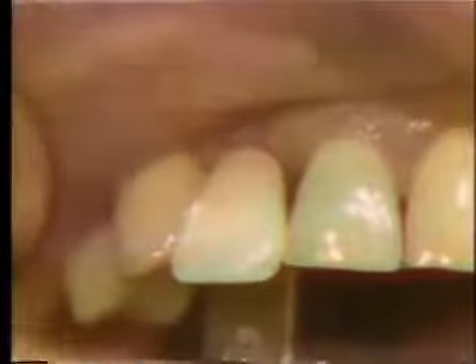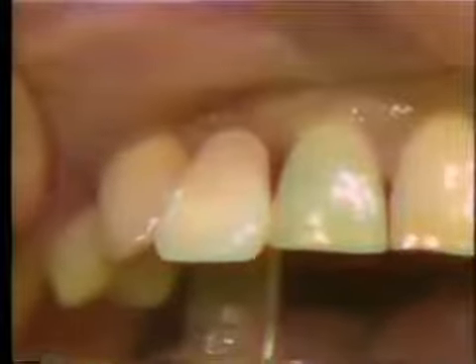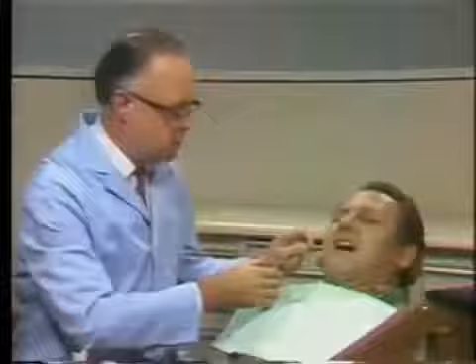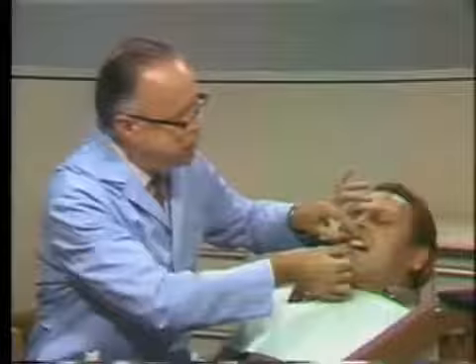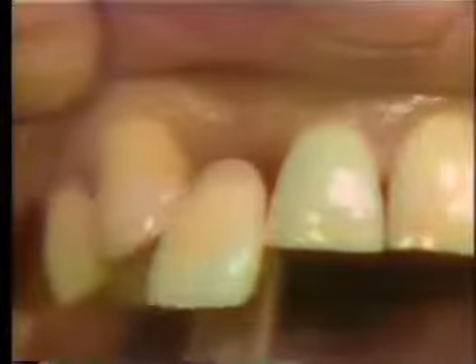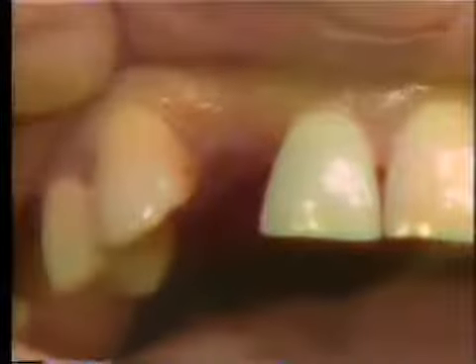This is shade 66, and it's a pretty good match as I see it from here in this particular lighting. We'll try 67 just to see how that goes, whether we're getting a little darker, a little too dark, or whether it's a little better match. And as I see it from here, I think that probably I would prefer the shade 66, which is a little bit lighter than 67.